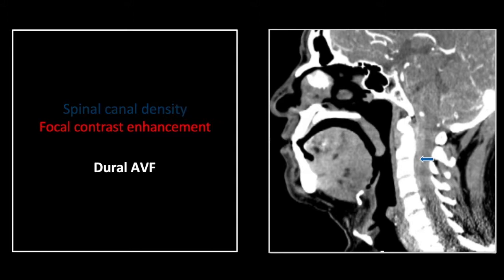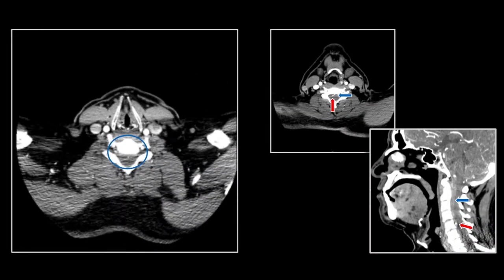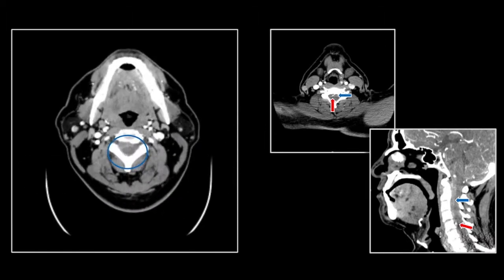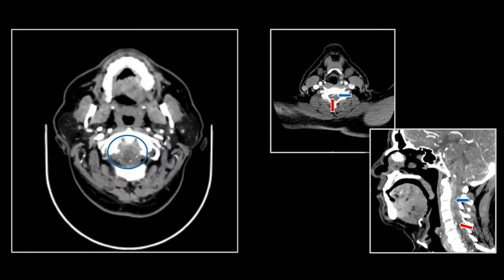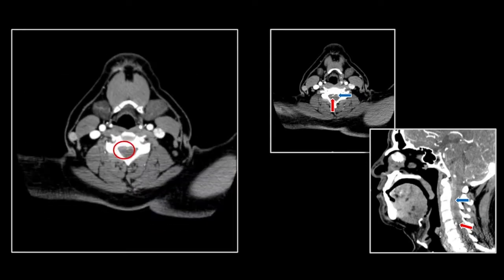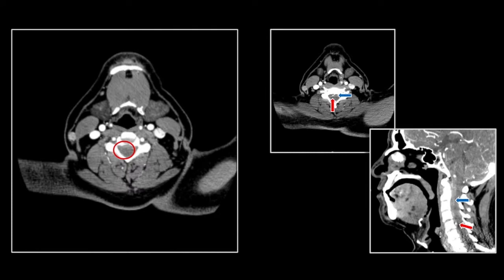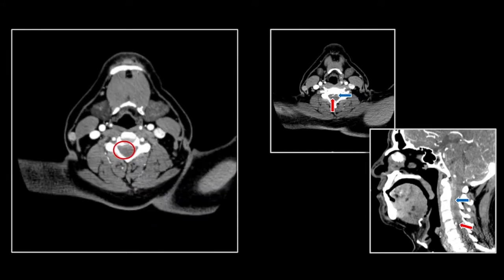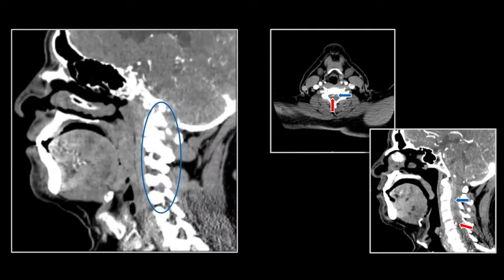Here it is on the sagittal. You can see the anterior density displacing the cord posteriorly, and here is that spot of increased density that represents the fistula. Appreciate the anterior density throughout the extent of the cervical spine going all the way up to the skull base. Let's look at that small dot of increased density and note the entering and exiting vessels — those are the feeding and draining vessels of this AVF.